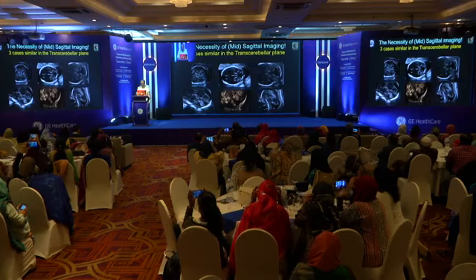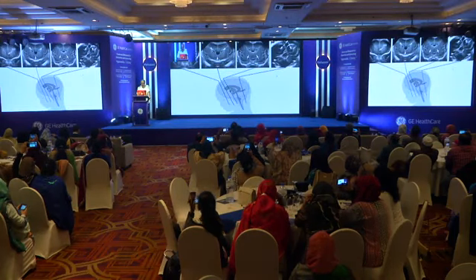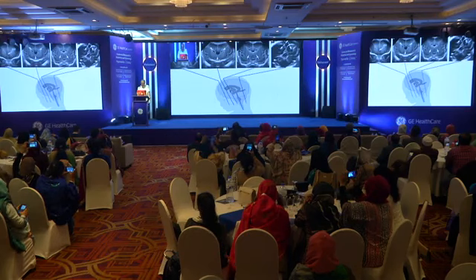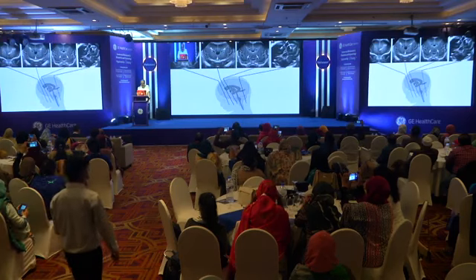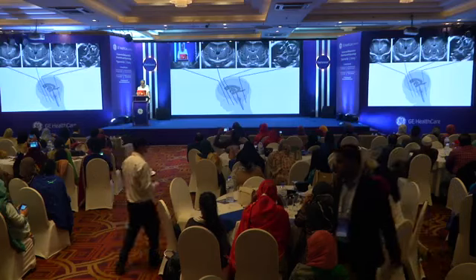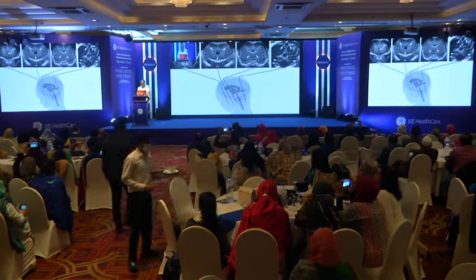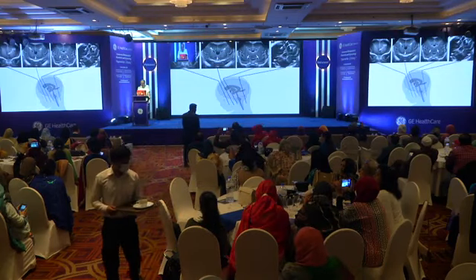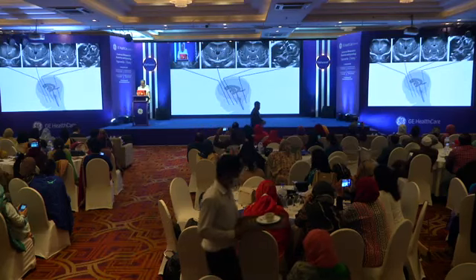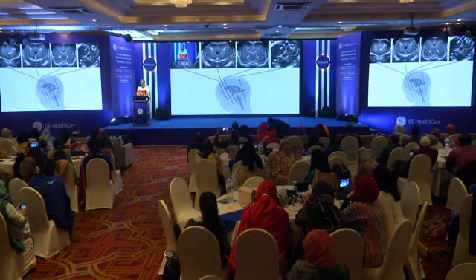Then, of course, we say, all right, the 4 coronal planes from front to back are the interhemispheric fissure, this plane, which is the transcaudate plane, the caudate nuclei are here, the lateral ventricles are here, the corpus callosum is above the cavum septum pellucidum, and here you have the interhemispheric fissure. As you go back and back, you have the transthalamic plane, because this is thalami and thalamus.